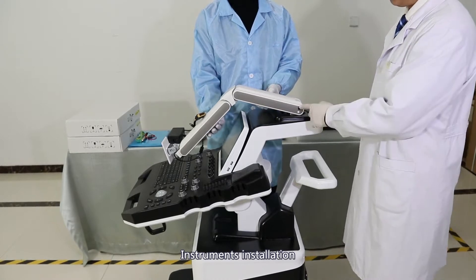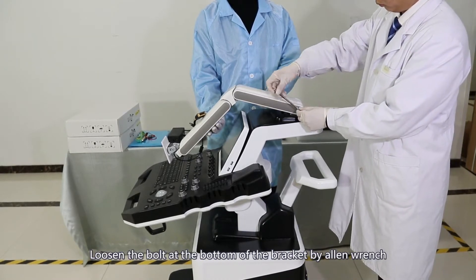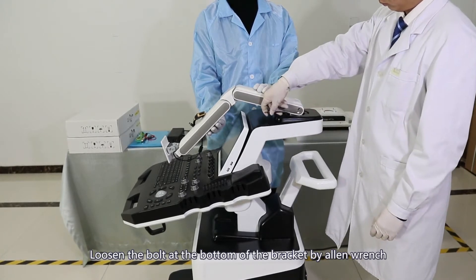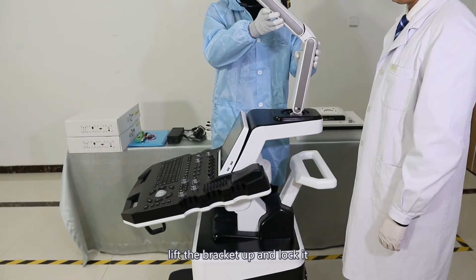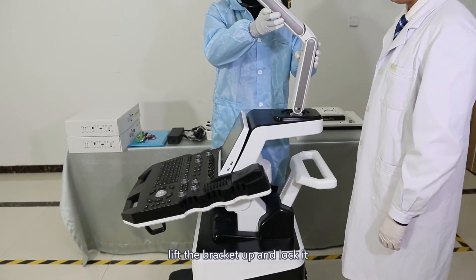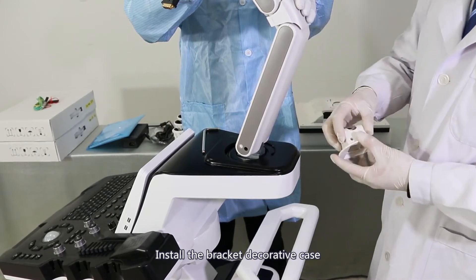Instrument installation. Loosen the bolt at the bottom of the bracket using an allen wrench. Lift the bracket up and lock it. Install the bracket decorative case.